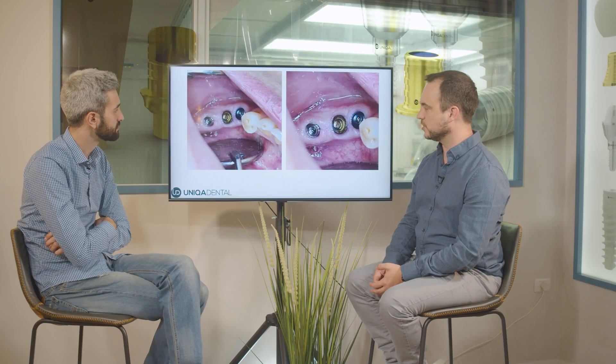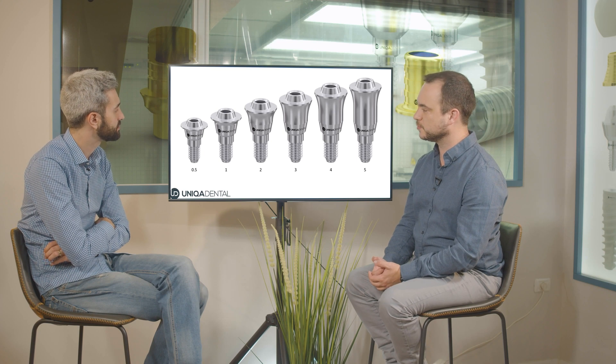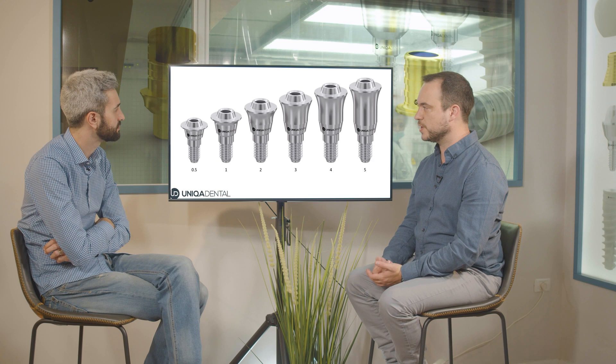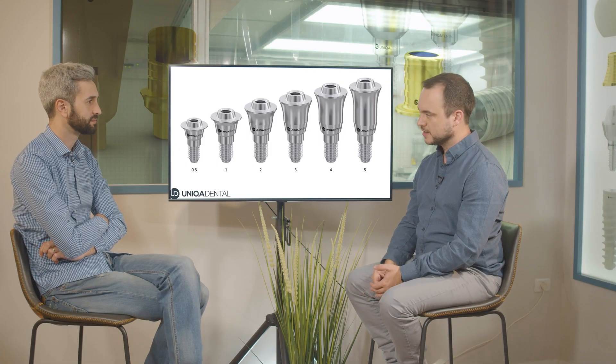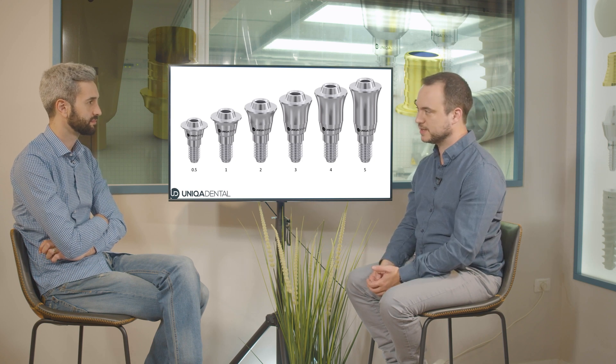Here you can see the three multi-units that will be restoring the bridge. These are the different multi-units being used. We took an impression on one height of multi-units, and then changed the height of one of them — this is one of the options available with Unica's V-type multi-units.